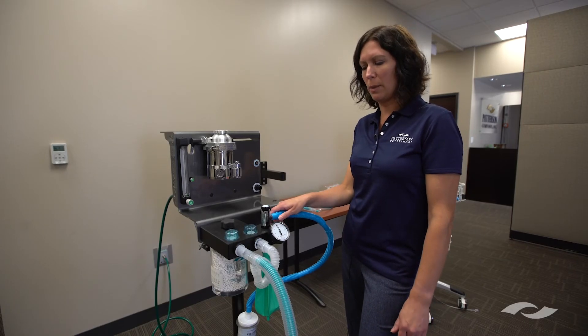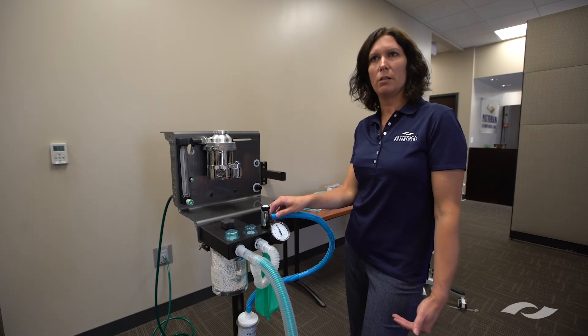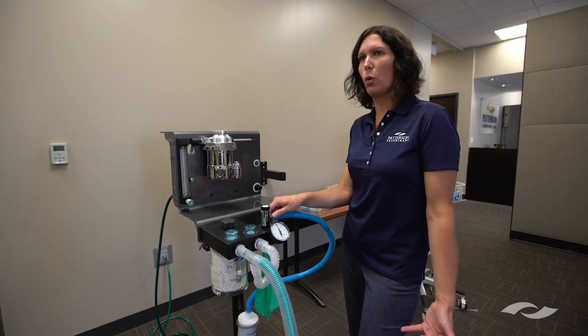If the pressure doesn't drop more than five increments over 20 seconds, then your machine is leak-free and you can go ahead and use it.